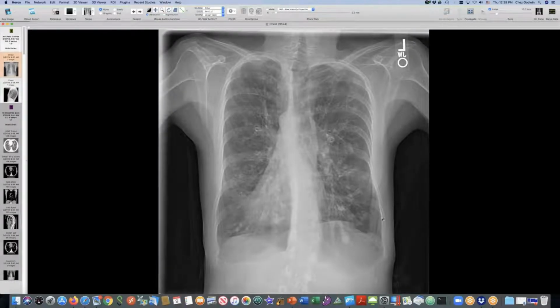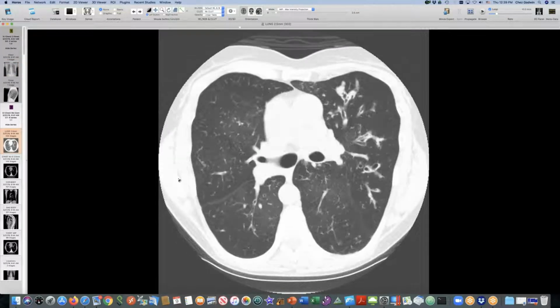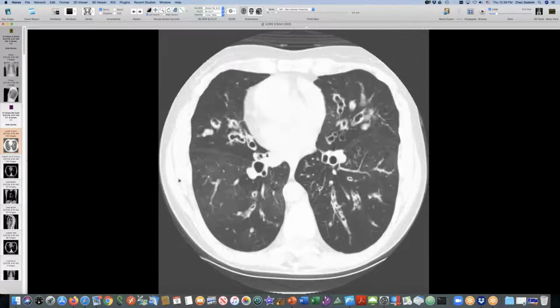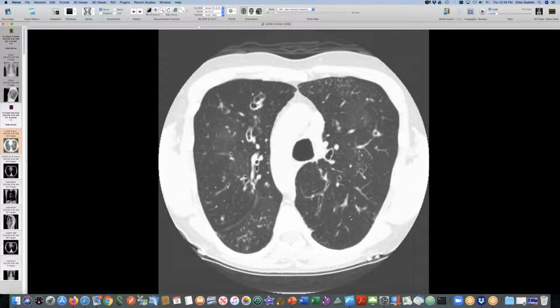Okay, can people see a person here with situs inversus? We can, yay. Okay, and bad bronchiectasis. This person also had sinusitis and has chronic Pseudomonas infection and some other bugs growing in these lungs chronically. Has nice mosaic attenuation reflecting the small airways component, the bronchiolitis obliterans that accompanies this, and is a transplant candidate. So it's a classic Kartagener. How did I do on the pronunciation, Jeff? Perfect, thank you.